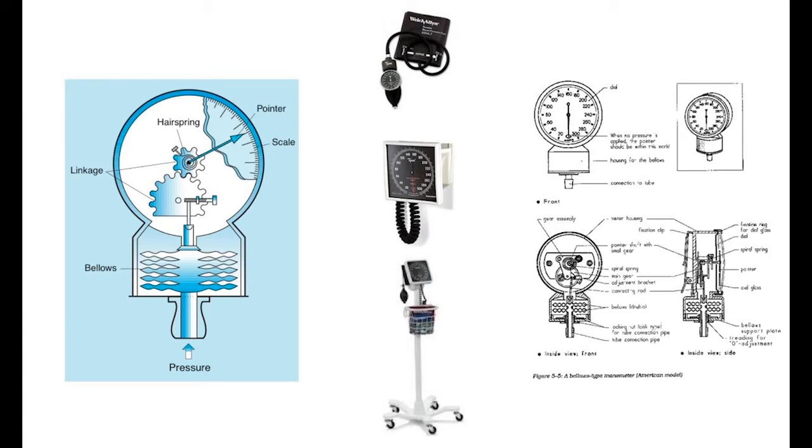And the recommendation, you'll see this and I'll say it again in a second, the recommendation is to make sure these things are calibrated when they're in frequent use, like these two, every 2 to 4 weeks. And the wall-mounted ones at least at 6-month intervals. We have 18 exam rooms in the kidney division that I work in, in our outpatient area. There's not a single one of our aneroid devices that has been checked by clinical engineering with a little tag on it in the 9 years we've been in our current building. And I think that that's not unique to the University of Pennsylvania.